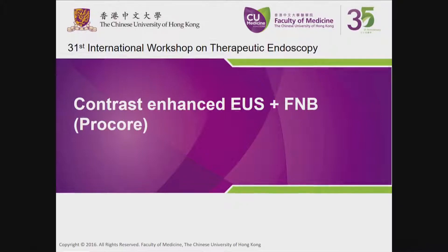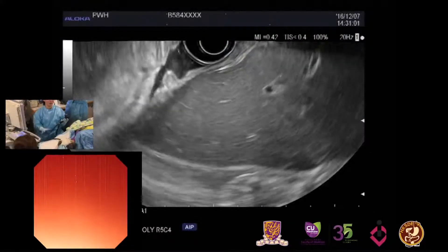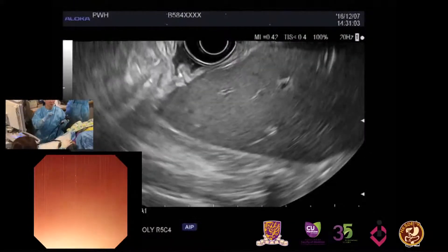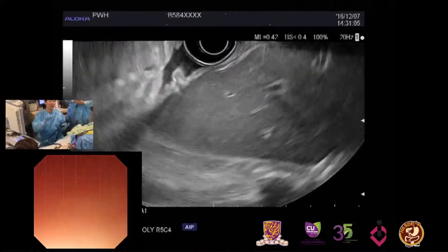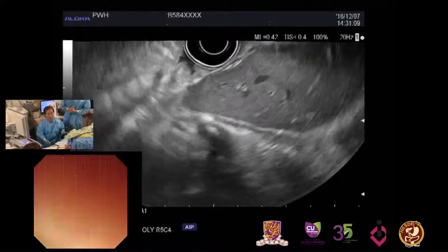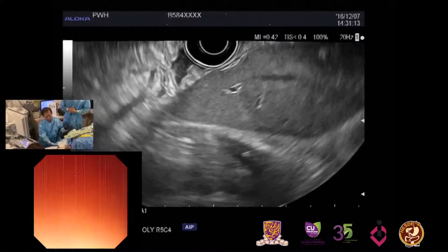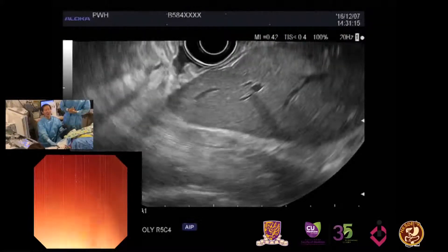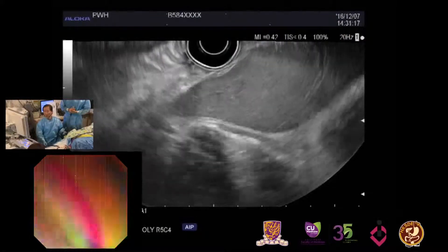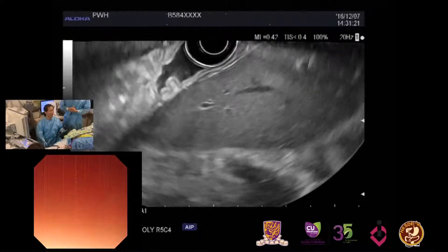Today we will have contrast enhanced EUS and also FNB with ProCore. This case has a huge mass in the space between the pancreas body and tail and the gastric wall. I inserted my echo endoscope. Generally I use a linear echo endoscope. These days I seldom use a radial scope. With the linear scope we can do imaging and we can do biopsy — most of the functions are available.